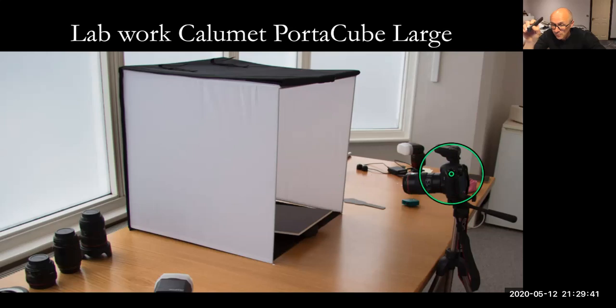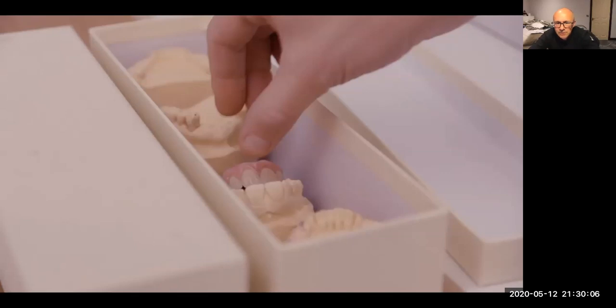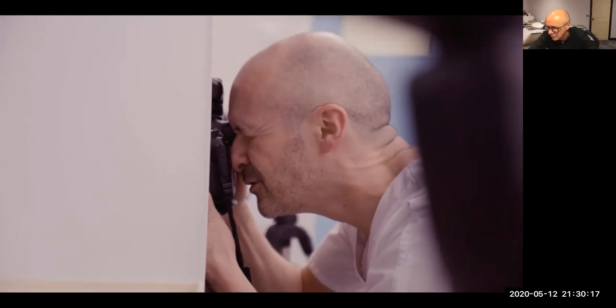I'll often have it on a tripod if I'm doing shots on the articulator. My camera's got a remote control for the flashes, so there and there. When I press the shutter, it ignites the flashes, but it puts it through the cube and it softens the light and makes the lab work look so nice. And this is how I do it. So say I'm going to photograph this here. I pick it up, put it inside the cube, take my camera and point and shoot.